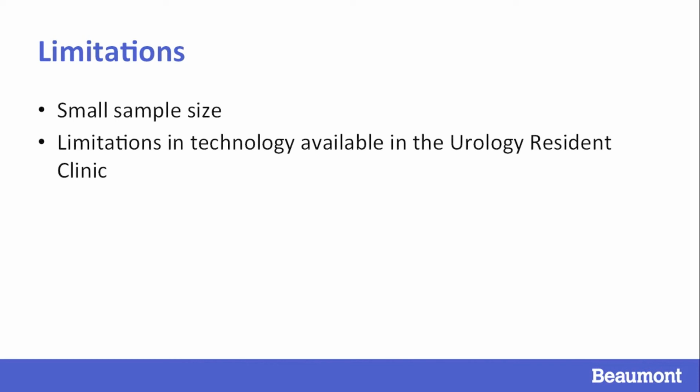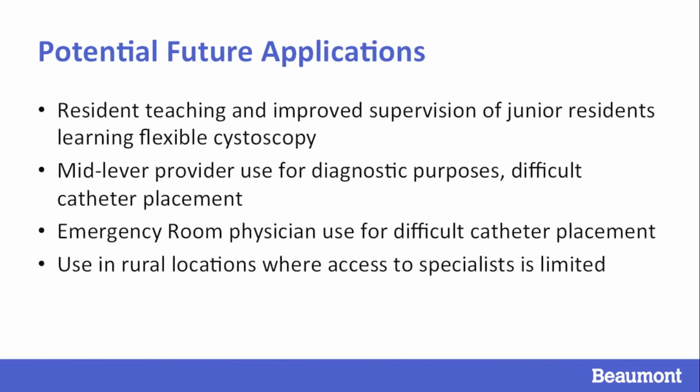Limitations of our proof of concept project include small sample size. Future applications for this technology include use for improved resident training in the performance of bedside cystoscopic procedures, mid-level provider use in performance of diagnostic cystoscopy, as well as difficult catheter placement, emergency room physician use for difficult catheter placement, and finally, use in rural locations where urologist is not readily accessible.